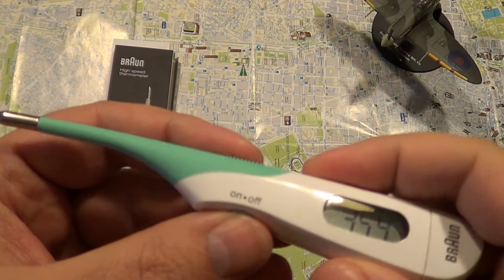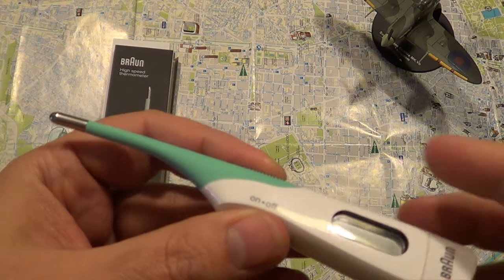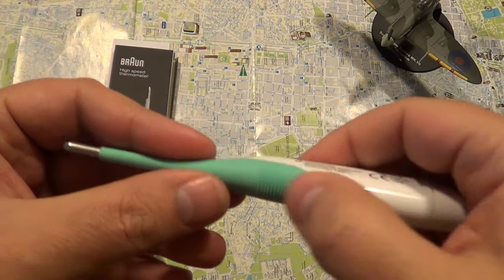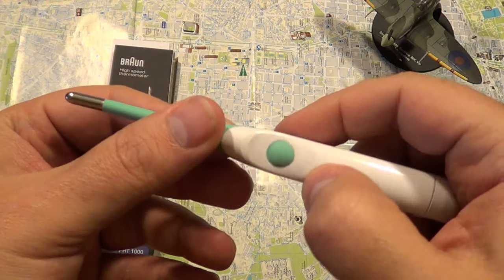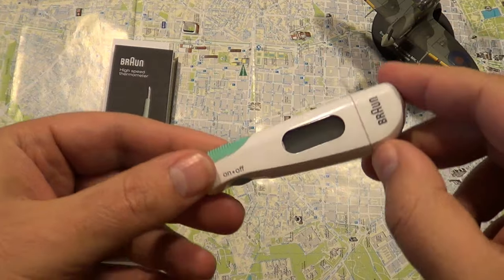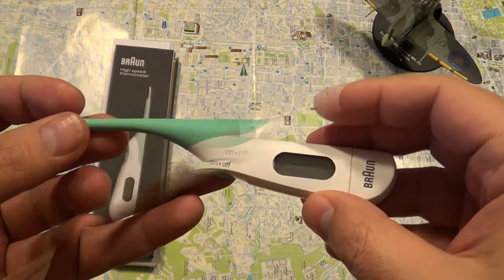It shows a temperature of just 35.4. I don't have a fever of course, but the good thing is that it can take the temperature in quite a short time, so it's good to use for kids but also for adults. Now how accurate the temperature reading is, I don't know — I cannot compare it with another thermometer. But it seems flexible and Braun is a good company. It takes a 1.55-volt battery.